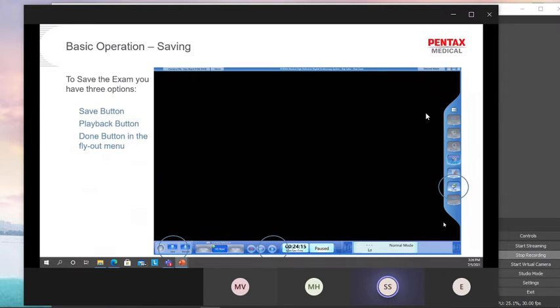So very rarely will the doctors want to pin it, but if you want to pin it, there's one pin icon here. You can do a pinning by clicking on the pinning. All right, so once you pin it, this fly out menu will be frozen at this position. But of course, very seldom people will do that. So if it happens, somehow someone actually clicks on the pin button and the doctor says, hey, I don't want this. So what can you do about it? You just unpin it. That's all.